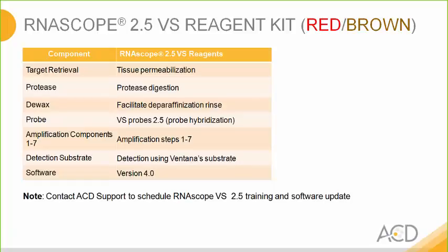If you are interested in running the 2.5 VS assay, we do ask you to contact ACD support to schedule the RNAscope VS 2.5 training as well as the software update for your machine.